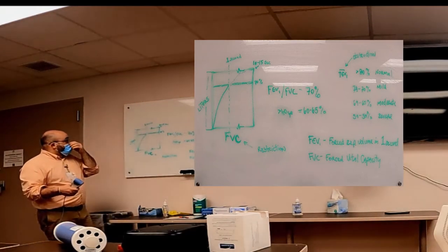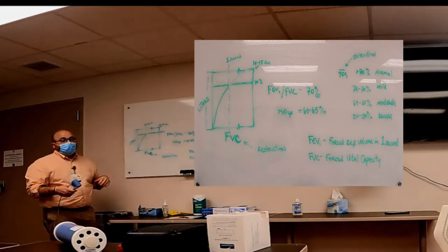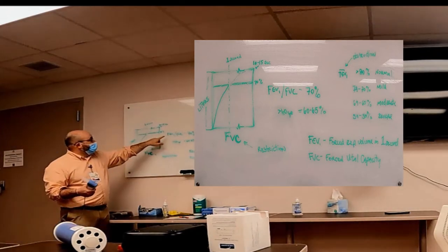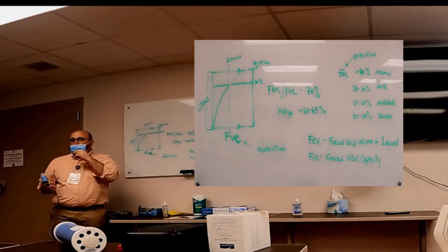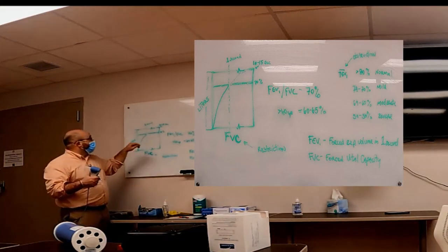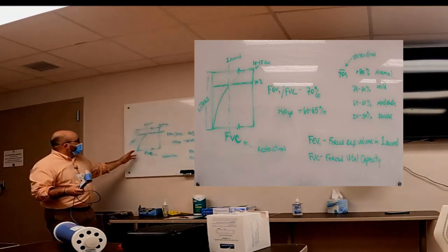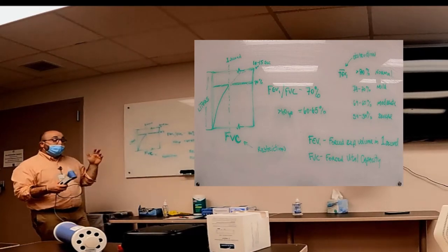So that's what we're looking at with that. That's reproducible. The flow is really important too. So if your forced vital capacity is good, which means you don't have a restrictive lung disorder, but for normal lungs, you're supposed to get 70% of that air out of your lungs in 1 second. So of your total amount of air, you should get 70% out in 1 second. That's what your ratio looks at, but that also looks at your flow, your speed that you're blowing out. So if you can't get the air out, like if this does not get up to the top here, your ratio is going to be off, but then your flow is going to be off. So you have a predicted flow also.